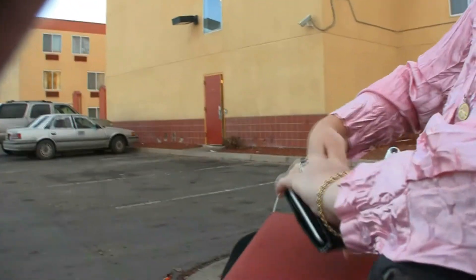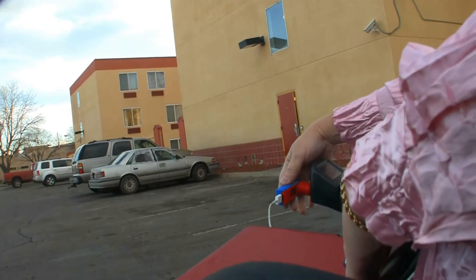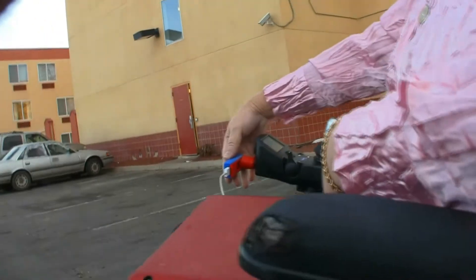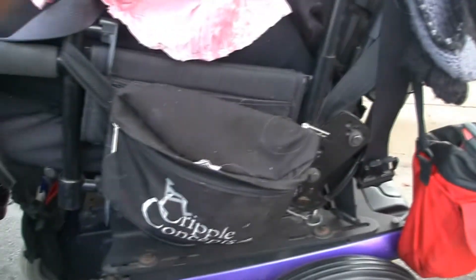I'm going to try to get an angle where you can see the numbers, but I don't know that I can. There's numbers right here — it says, I think it says 552. I have no idea what that means. 25.2 — that's how many volts are in the chair. It's upside down at that angle, but... okay, so I guess that means that it's working.